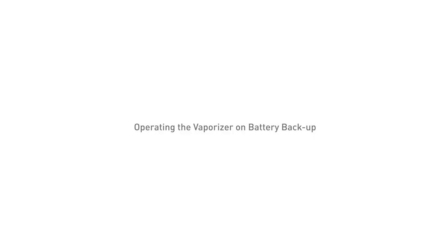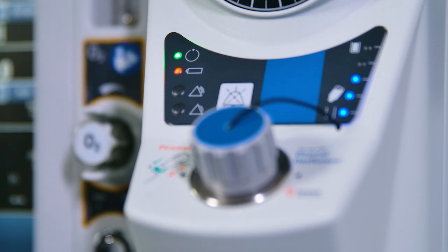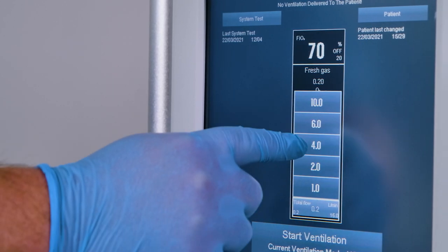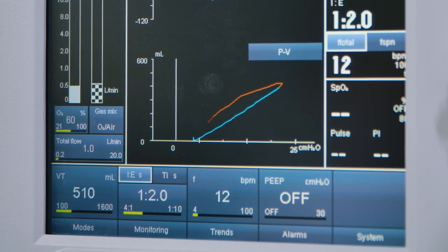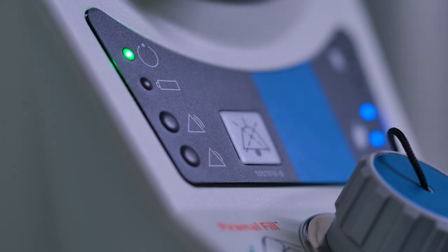Operating the vaporizer on battery backup: if the battery is in a charged state, changeover is instantaneous if the mains power supply fails, and the vaporizer remains in operating mode. When the battery is in use, a periodically repeated single audio tone sounds and the indicator will flash. A fully charged battery will power the vaporizer for a minimum of 5 minutes at a set concentration of 6% and a fresh gas flow of 4 litres per minute. At higher settings, the backup period may be shortened, but may extend to a maximum of 30 minutes depending on fresh gas flow rate and concentration setting. The battery will be recharged automatically when the mains electrical supply is restored. The power indicator will flash until the battery charge reaches a safe level to provide at least 5 minutes of battery backup, then the battery indicator will light continuously until the battery is fully charged.